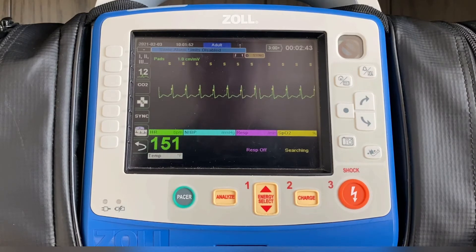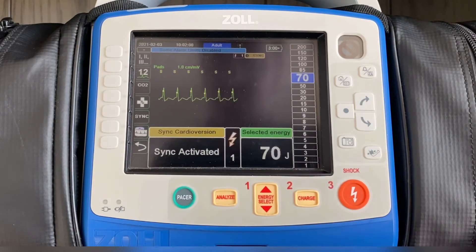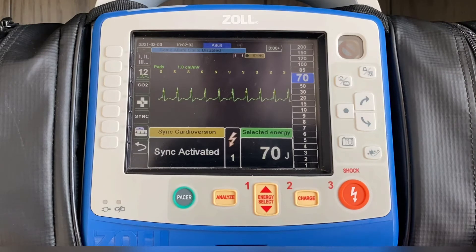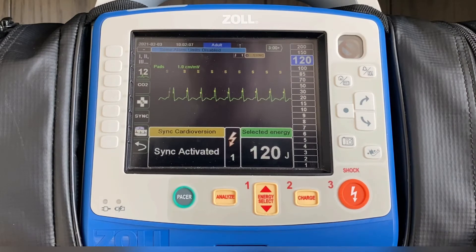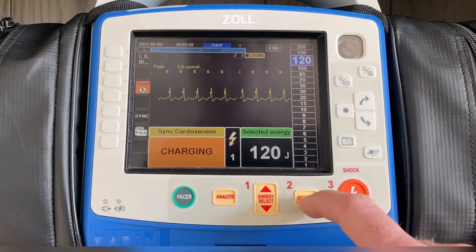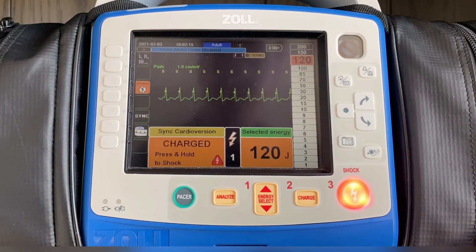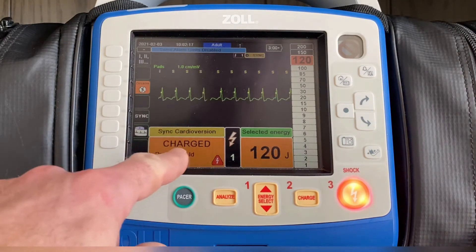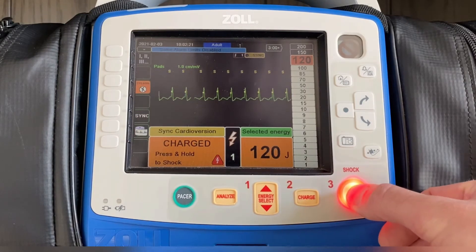In this case, because I dictated the energy level by manually pressing energy select down, when I go in to select it again it's going to remain at 70 joules, which is what I pre-selected it at. Our recommendation is then to go to 120 joules, press the charge button, and just like the first time, make sure it says "sync cardioversion" — press and hold to shock. Make sure everyone's clear, deliver energy.